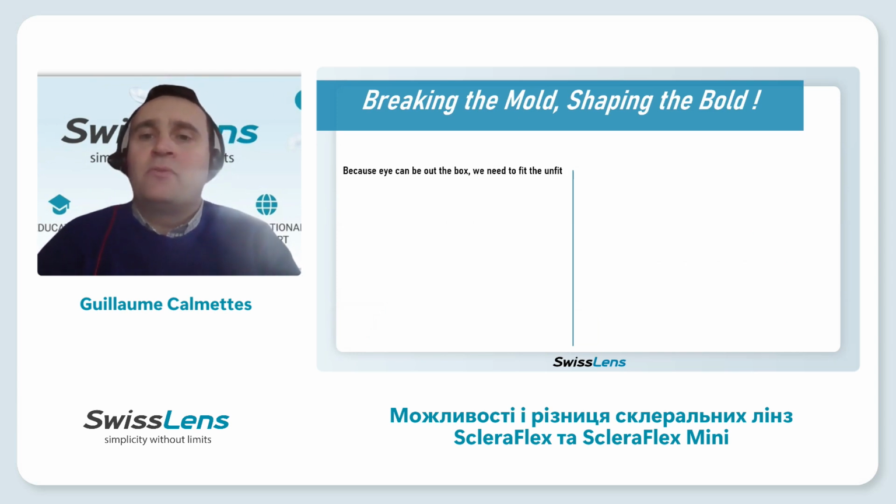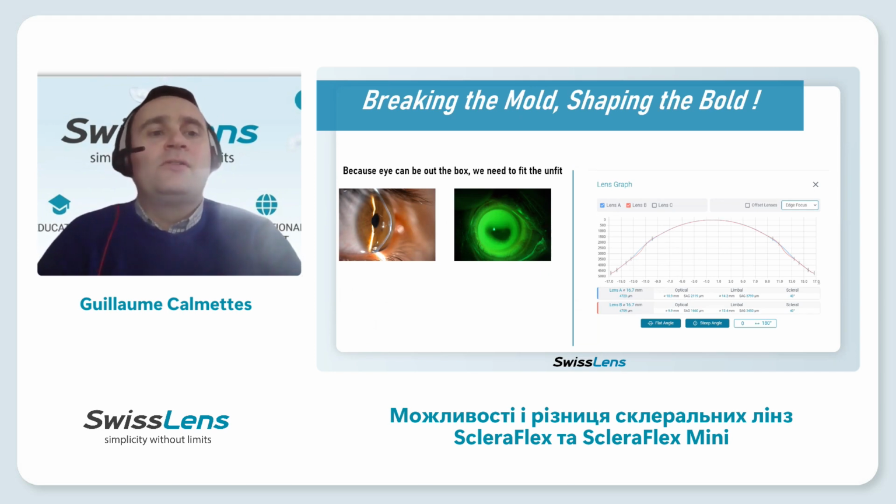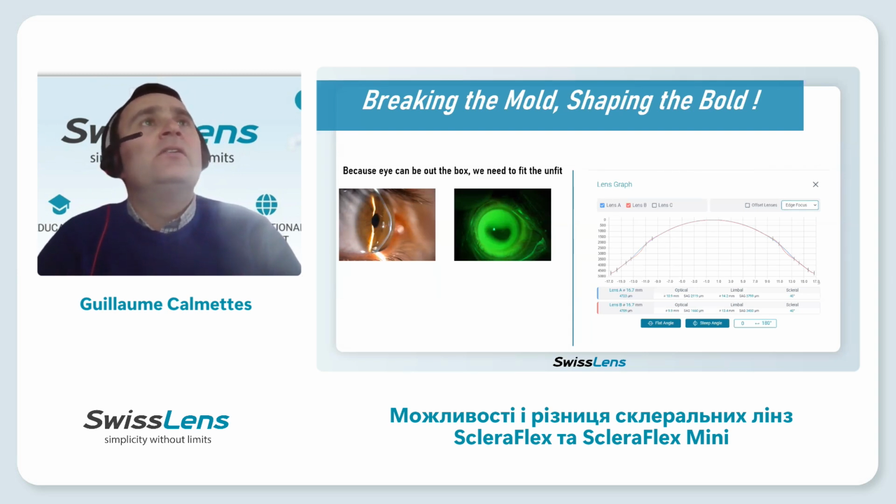A little bit of example. For example, this is what we can have in our daily practice. We can see clearly the eye is very sharp on the periphery and has a very flat cone in the middle. If you put a lens on, on the graph on the right of the screen, if you take the lens like the blue one, you will have a problem. You will touch the cone, and you will have a problem. So you can choose and make something a little bit different.